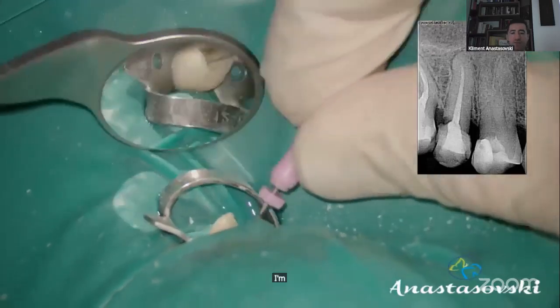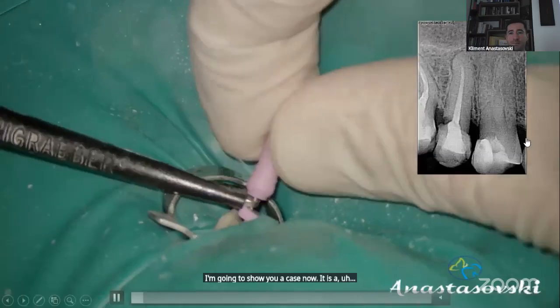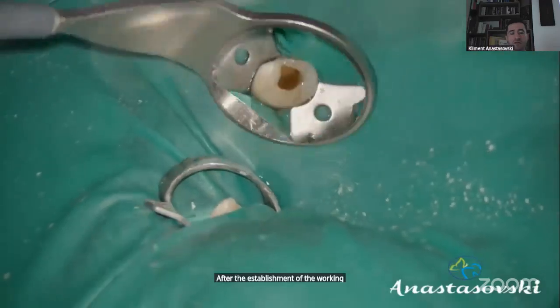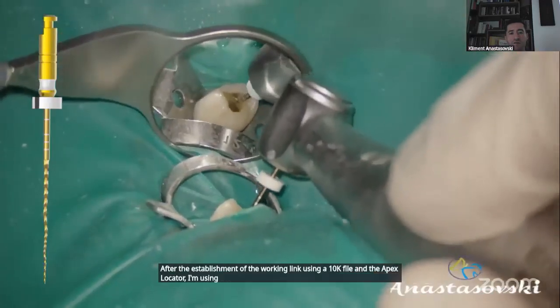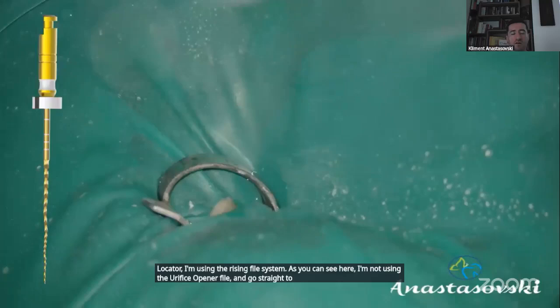I'm going to show you a case now. It is a first premolar, sorry. After the establishment of the working length using a 10K file and the apex locator, I'm using the RISING file system. As you can see here, I'm not using the orifice opener file and go straight to the R1.